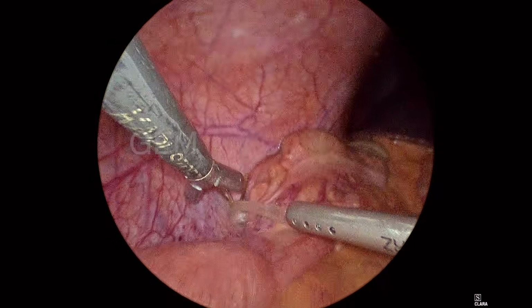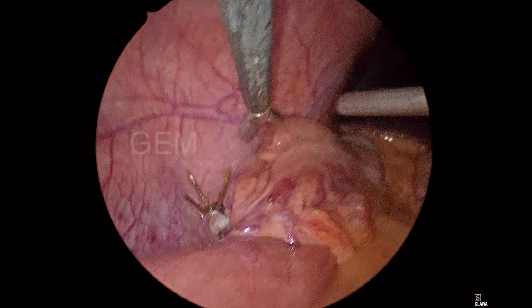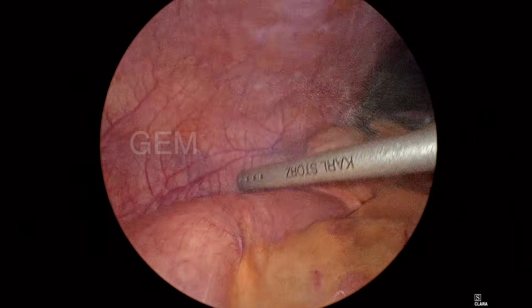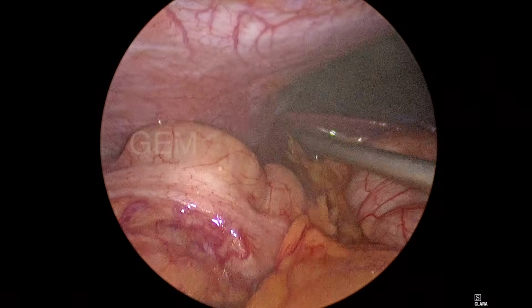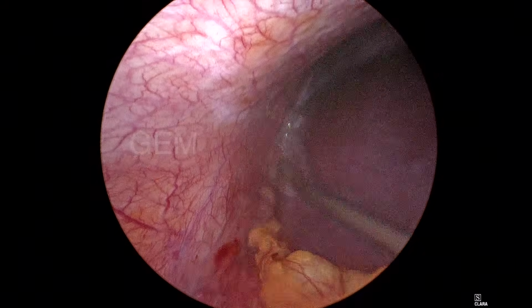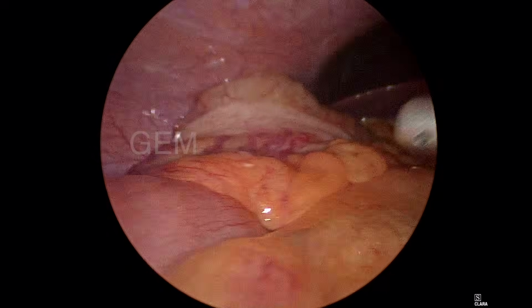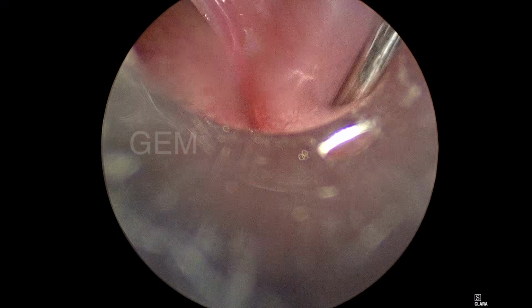So that is the paracolic appendix. Not much bleeding or any content is coming out. Anyway, giving a nice wash is good. Give the wash like this, particularly in the subdiaphragmatic area. The carbon dioxide will be there, and that will become carbonic acid, so you take it out, so that the postoperative shoulder pain will be less if you give a wash to the peritoneal cavity.